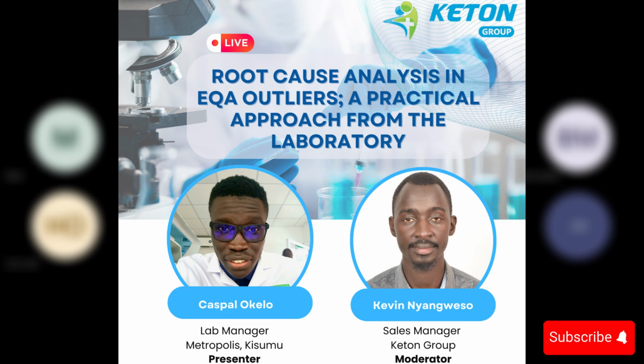As we said, EQA is like a stress test for your laboratory. Is my system working well? If I run my sample here and somebody runs it in a peer lab in Mombasa or in the US, is it going to give us the same or an acceptable value, such that clinical decisions will be made in the same way? If your EQA is failing, you are inaccurate. If your EQA is passing, you are accurate. If your IQC is failing, you are not precise. Thank you.